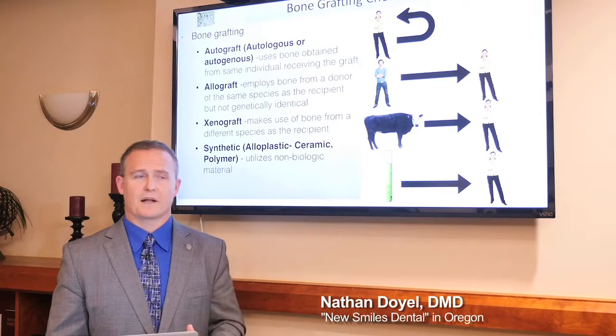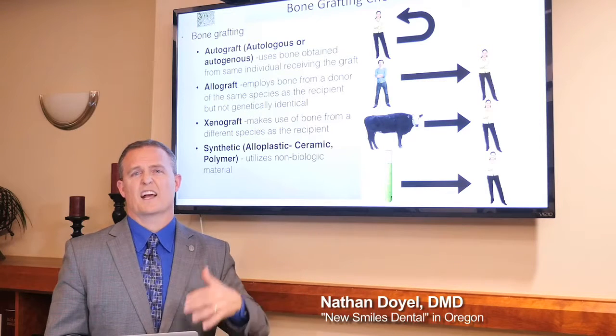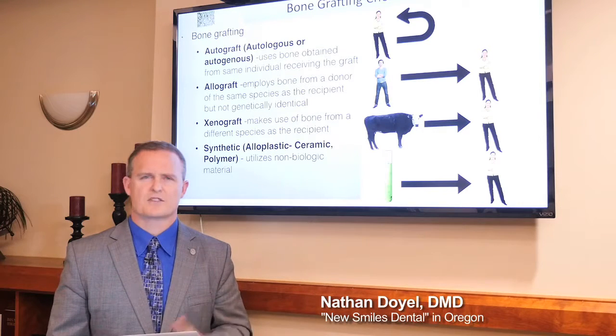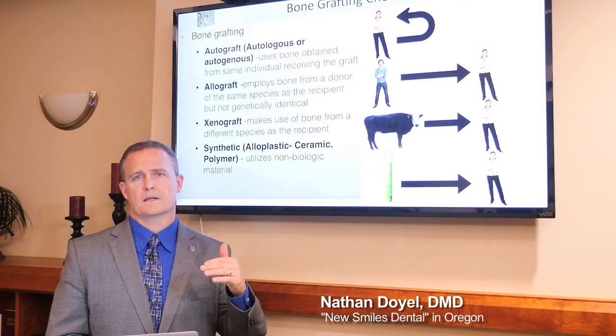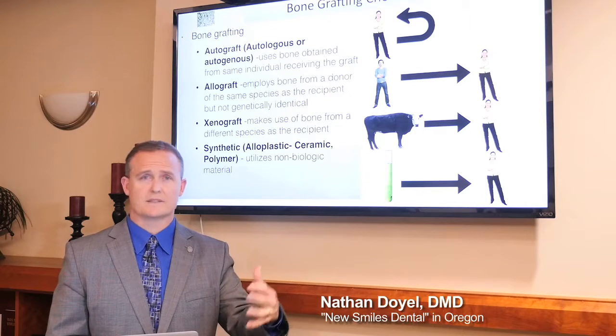They might have an implant, so you might choose to do a xenograft or a cortical bone so that it has a delayed turnover. It's longer. Synthetic usually doesn't go away. There's some materials out there that do dissolve or resorb over time, but many times some of the synthetics will actually stay in place forever. You'll see it in place years later.